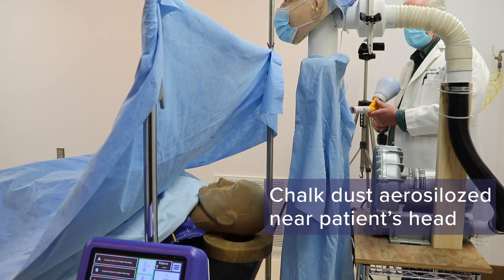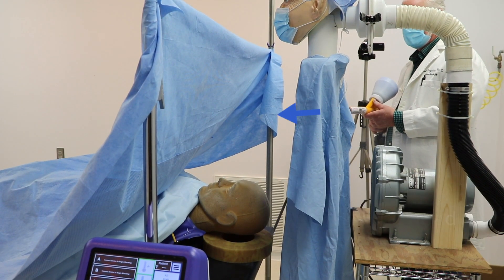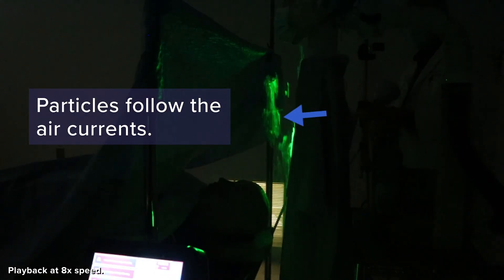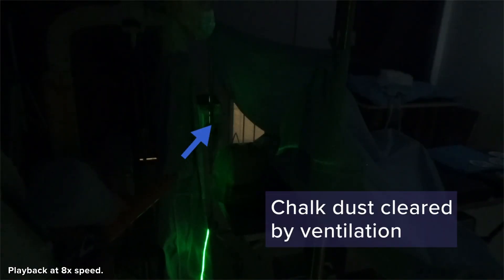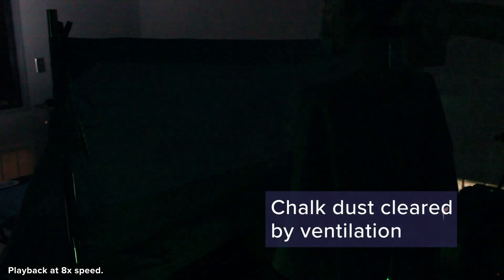Chalk dust is aerosolized near the patient's head under the anesthesia drape. It is sprayed ten times from the same angle and position as the forced air warming experiment. With no waste heat, the chalk is cleared downward by the laminar flow ventilation.